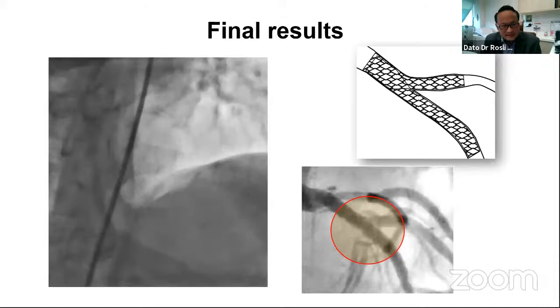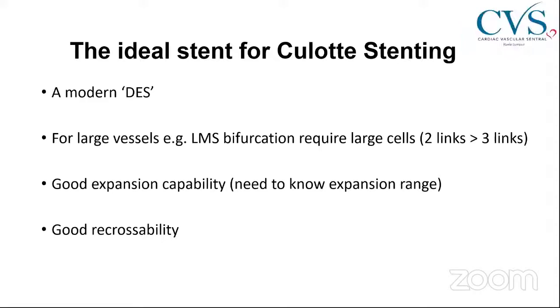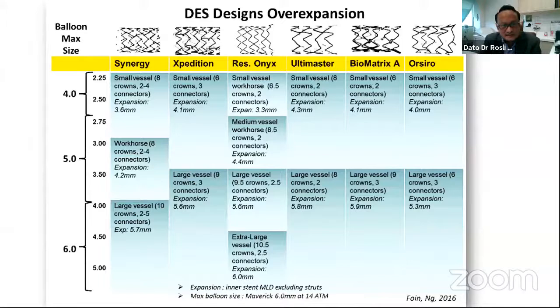Now, one of the other things to consider when you put in the stent, especially into a large vessel like the left main stem, would be the ideal stent for culotte stenting. Obviously, one has to use the current generation stents. For large vessels, you need to have large cells that will be able to expand very well. You also need to know the expansion capability of each stent that is available right now with regards to the stent size and also with regards to the vessel size. Good recrossability is one of the key things to have in an ideal stent, because that will make your procedure so much safer. So these are some of the designs for over-expansion. Some of the current stents that we have now can enlarge much more than the actual size of the stent to start off with. So any of the stents, as long as you're comfortable with it and you're familiar with the stents.